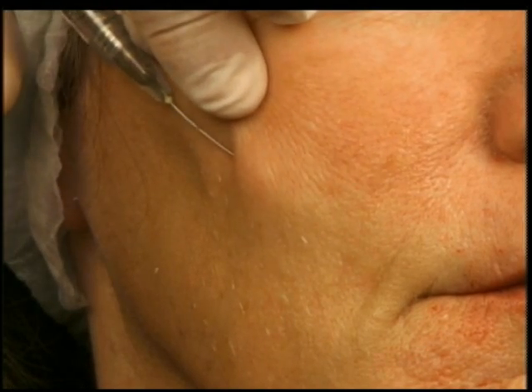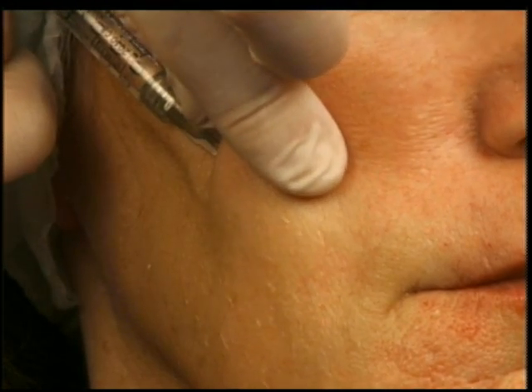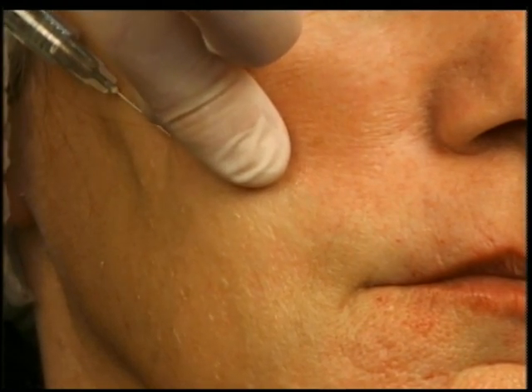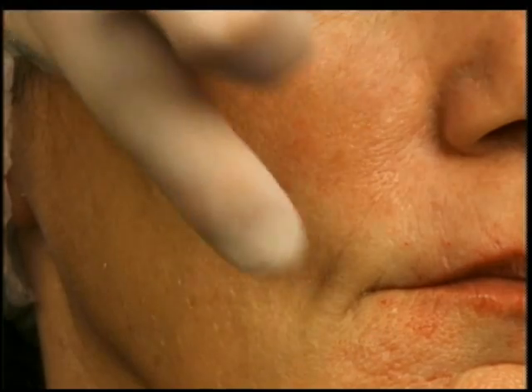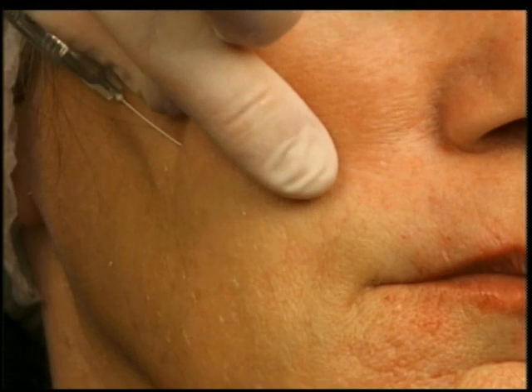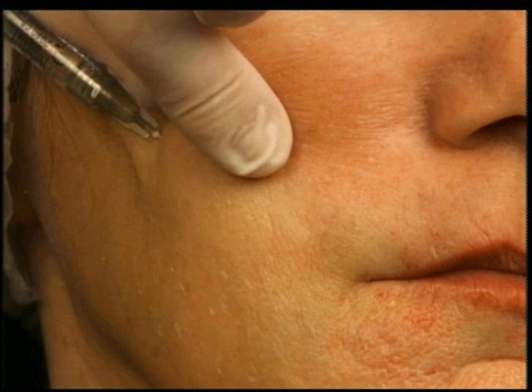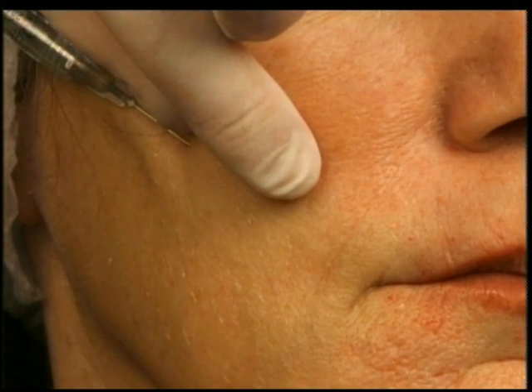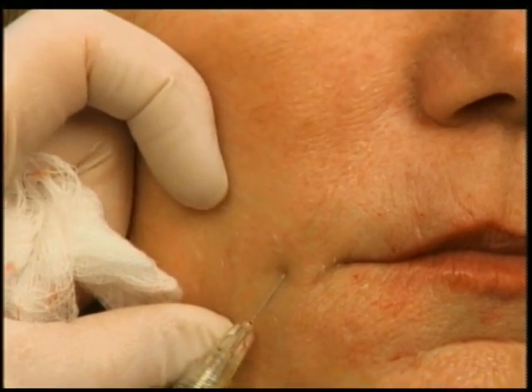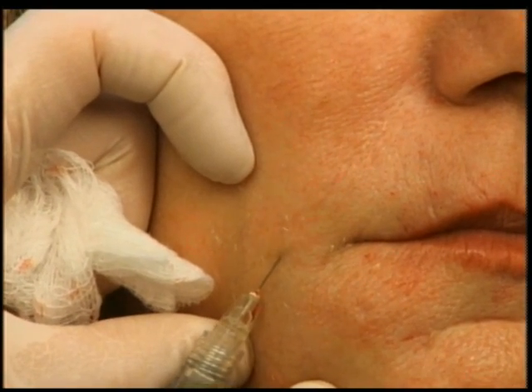I want to show you one way to lift up the corners of the mouth, especially when there's some redundant skin outside the corners. I sometimes come in from the cheek itself and come down towards the corners of the mouth using a longer needle — sometimes a 28 gauge, advancing to a 27 gauge, 1½ inch. Using these threads almost like a vector approach, I can bring the corners of the mouth up toward the zygoma, almost providing a support structure, also going underneath the line itself to lift it. Here I'm just directly below the line, trying to stay intradermal so I get resistance the whole way up.